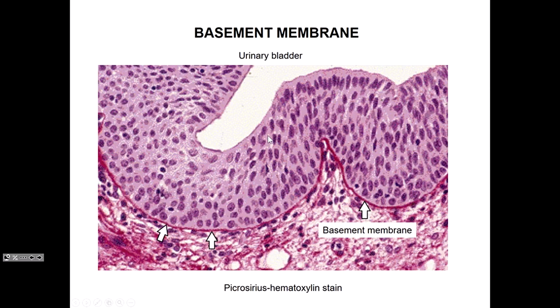Okay, so here's more bladder. Collapsed. Still not seeing these binucleated cells. Jeez, I have to throw one in there somewhere one of these days. I know I have a good example of one somewhere. Might be in Wednesday's lecture. But you can see here how these cells are really bunched up now in this relaxed bladder. Okay.